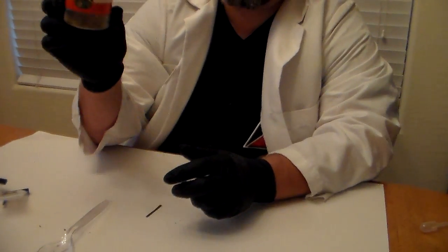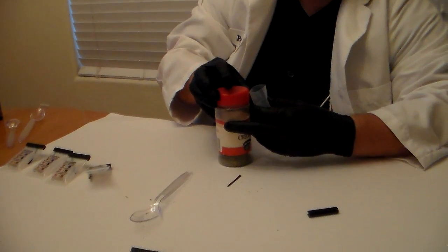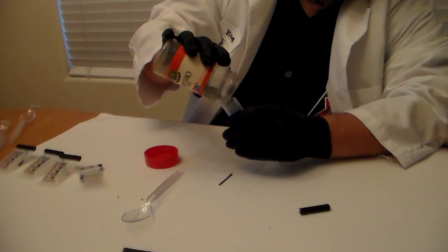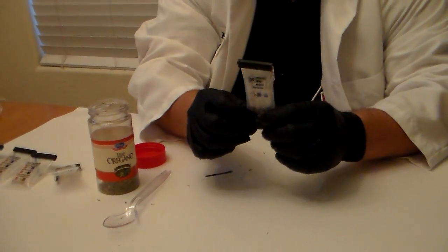Now let's test something else — oregano. Let's put our marijuana aside. Oregano is a common spice used especially in Italian cooking. Of all the spices, it actually looks closest to marijuana in terms of its physical appearance. So what we want to figure out is: does oregano, even though it looks like marijuana, actually test positive for THC the way marijuana does? We're going to take another one of our Duquenois-Levine reagents, open it up, open our can of oregano, and dump just a little bit in. We don't need very much — just a pinch. I'm going to tap it down there, close it off, and put the clamp back on.